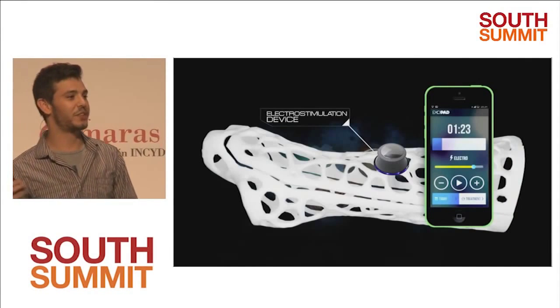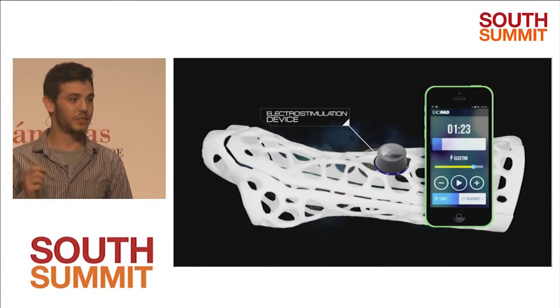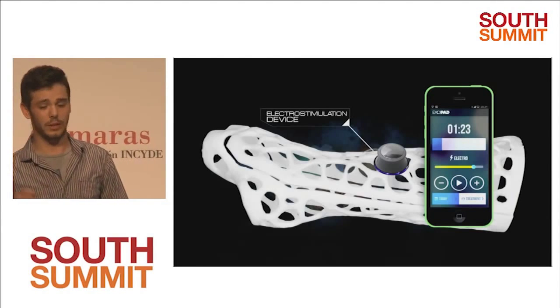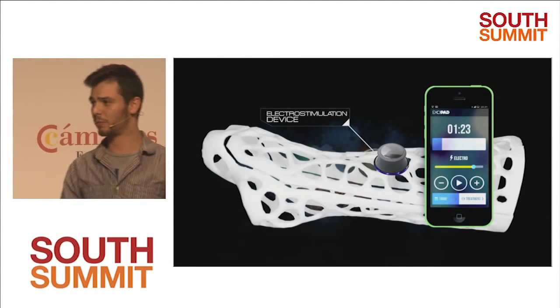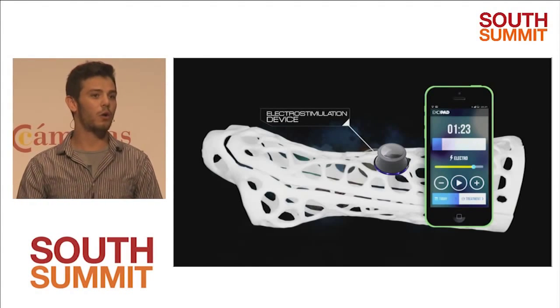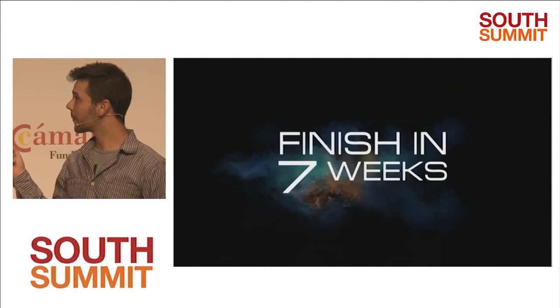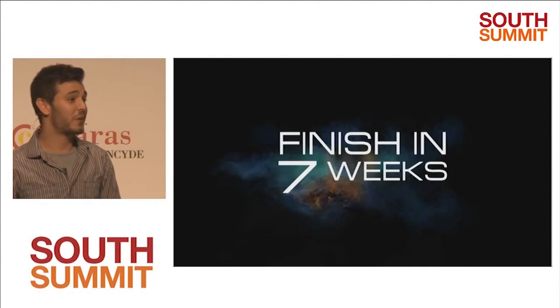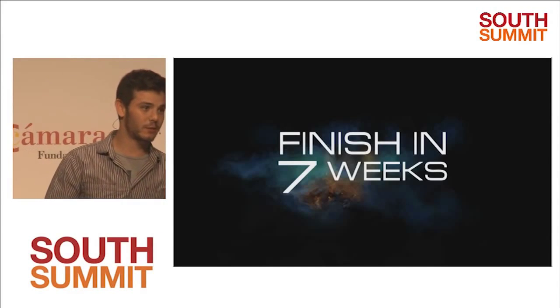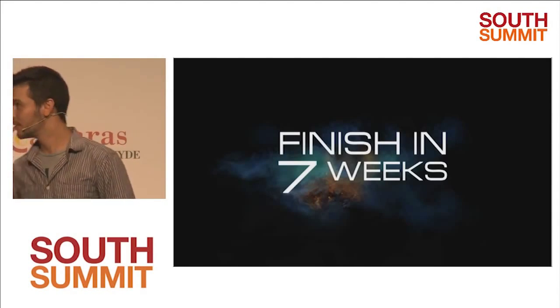An electrostimulation device that is controlled by an app on the patient's smartphone is used combined with the splint. This device is capable of performing the rehabilitation and measuring the muscle mass index, all without ever removing the splint. Instead of an average of 10 weeks, we achieved the recovery in less than 7 weeks.